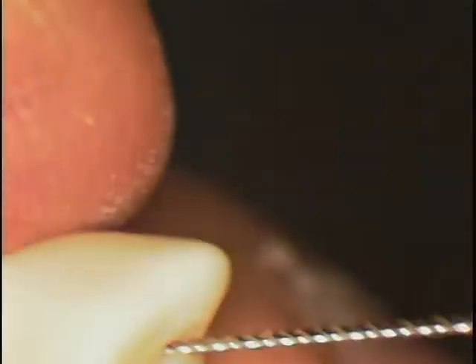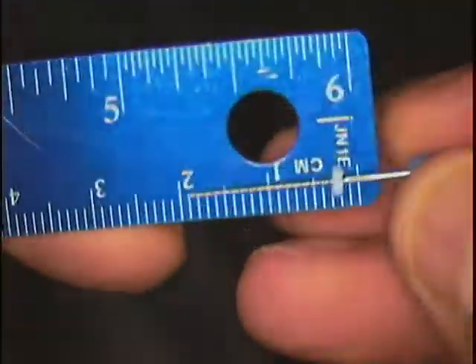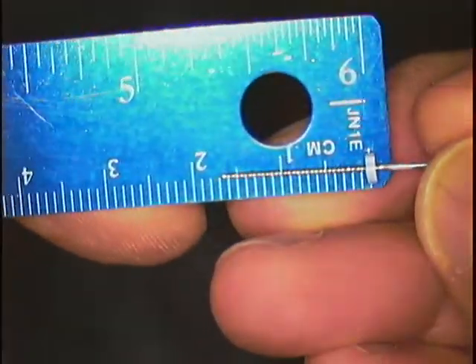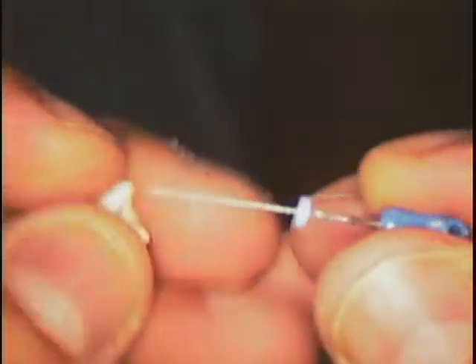Okay, so I'm up to a 30 file, and now you see where I'm getting. I'm going to push this in there, but not push too hard. See where it stops. This one stopped there. Let's just see if I'm close. Measurement. All right, it's down about a 17, so let's just see. That may or may not be true. So I'll push it down a little bit more. It stops right about there.